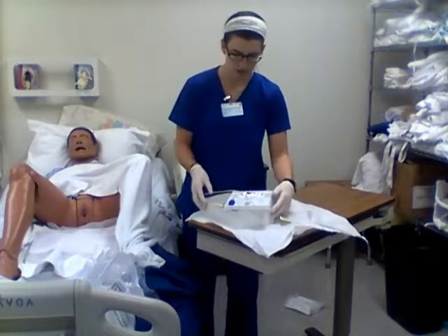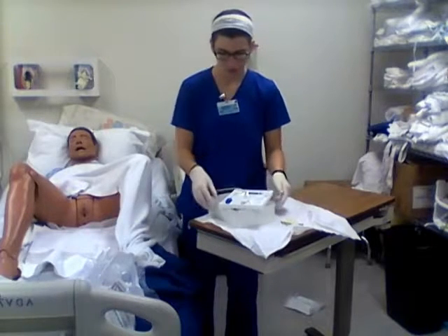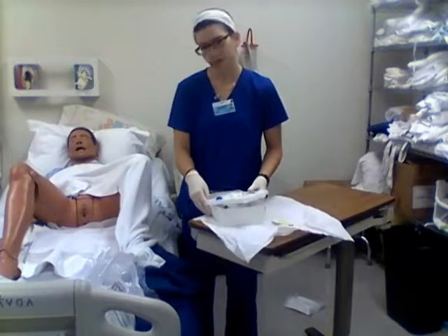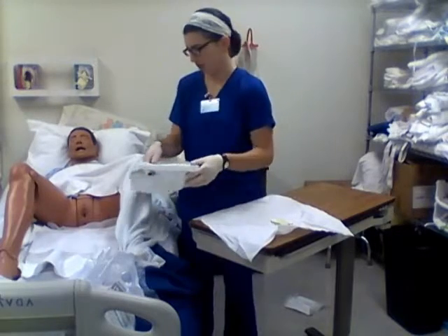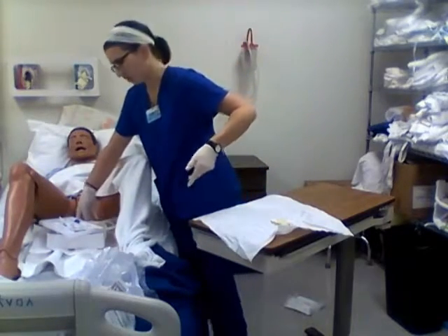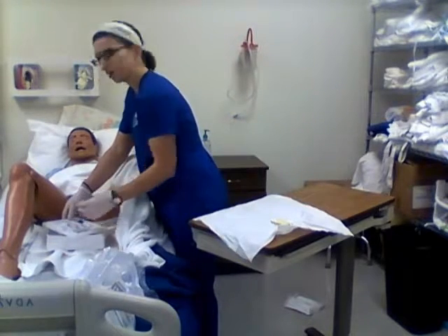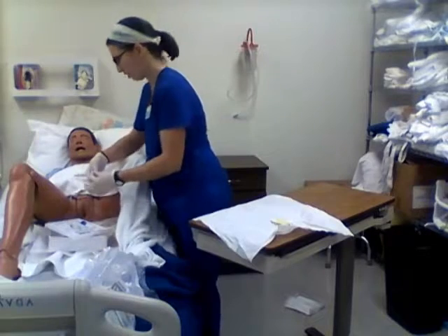So we can go ahead and we can move this onto our sterile field down with the patient. So we can go ahead. And now since I've turned my back to this, I can't really use it ever again. So now I'm going to clean the patient with my swabbing, which looks like you can see it pretty good.